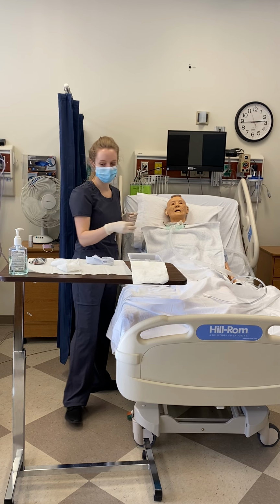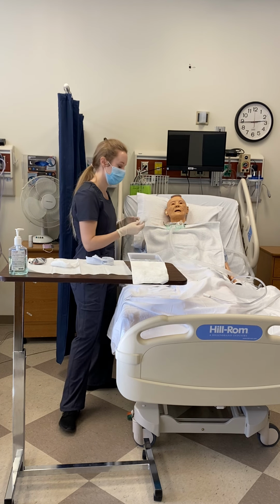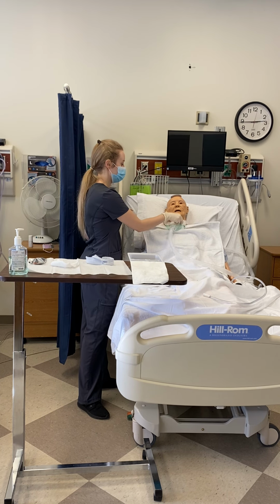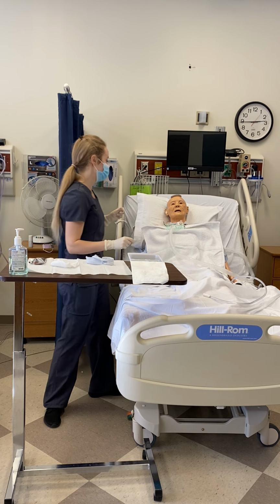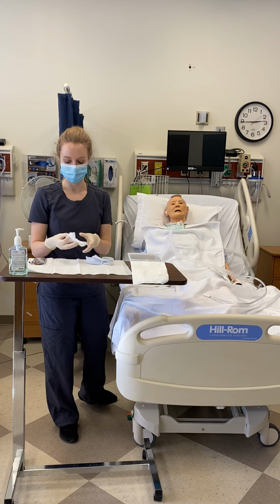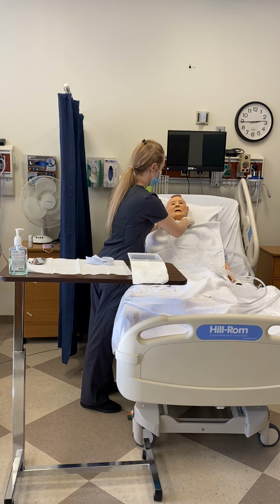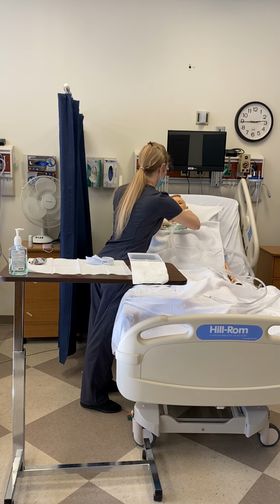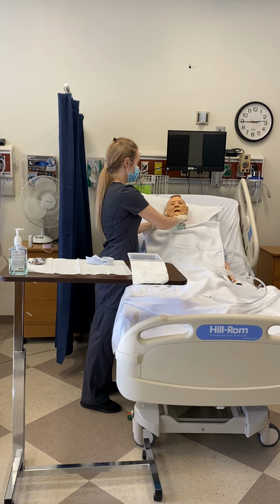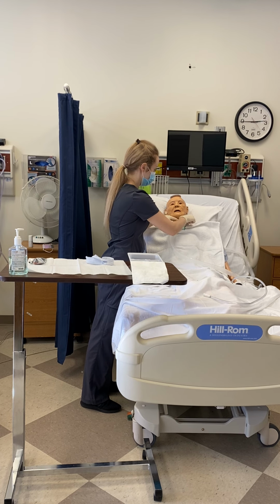And then I also want to take a dry gauze, and I want to dry this very thoroughly, make sure there's no moisture resting on the skin. And at this point I do break my sterility because I touch with both hands to get this dressing back on and up around here nice and securely. And normally I would want to have somebody maybe help me with this part because I would really want to avoid dislodging that trach.